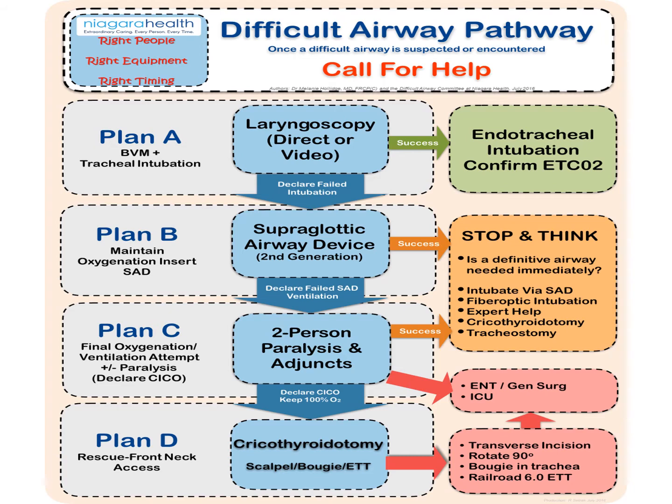And then the second component, the main piece, is our actual pathway, showing clearly laid out Plan A, Plan B, Plan C, and Plan D, with a focus being on a stepwise progression of steps with equipment and how to proceed. And we're going to focus on each aspect of this as the presentation continues.